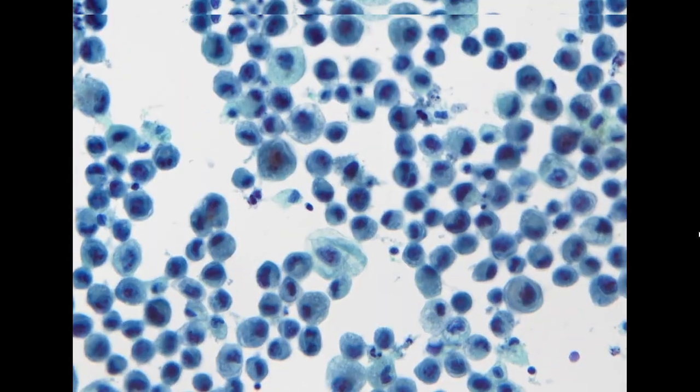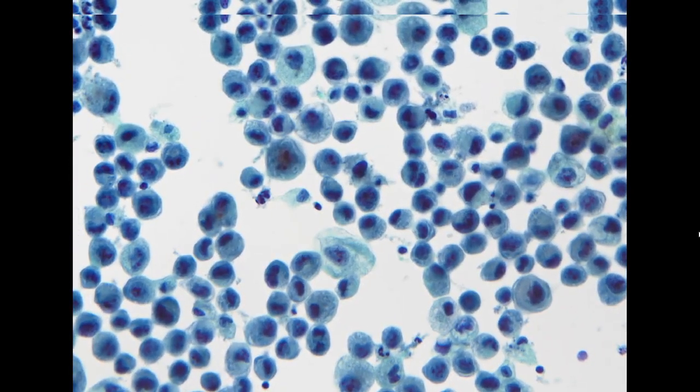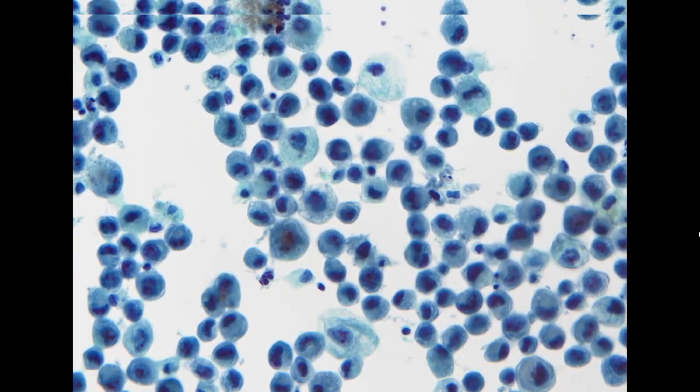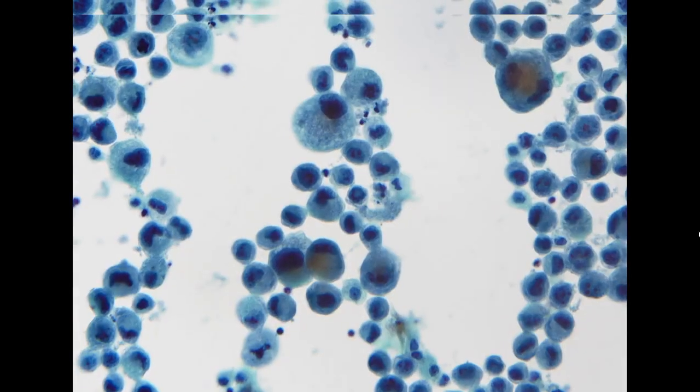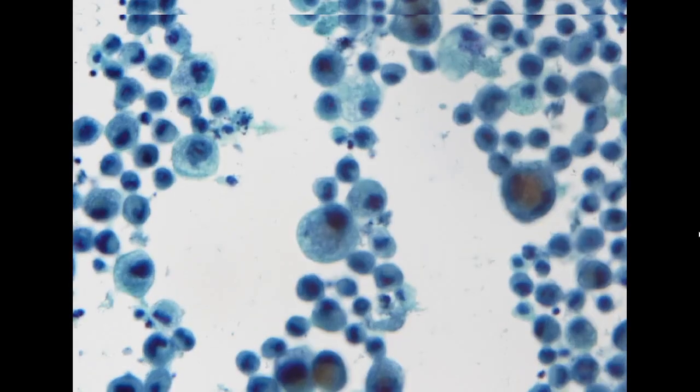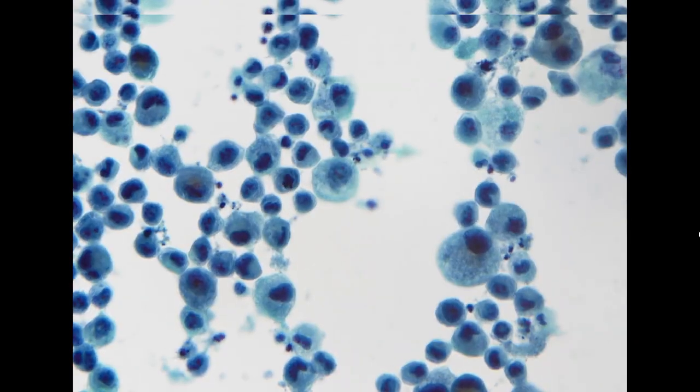When you go to higher power, you can appreciate the typical nuclear atypia of a poorly differentiated adenocarcinoma. The chromatin pattern we would describe as vesicular. Here it is not very prominent because our stain is a little bit too dark, but you can appreciate smaller pale, white areas, which we call a vesicular pattern.